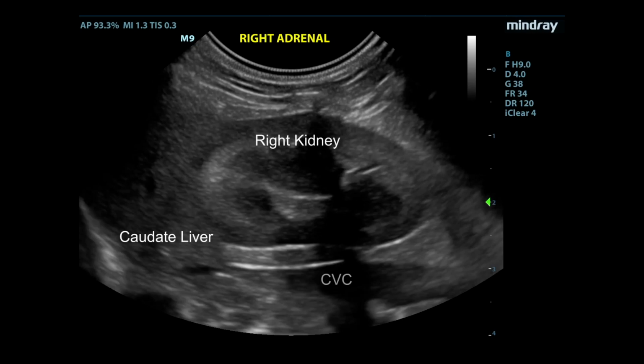We are satisfied if the patient shows no symptoms of adrenal disease and the measurements of a normal right and left adrenal gland are similar. If the measurements differ considerably, we recommend repeating the measurements of both adrenals using different methods if necessary.